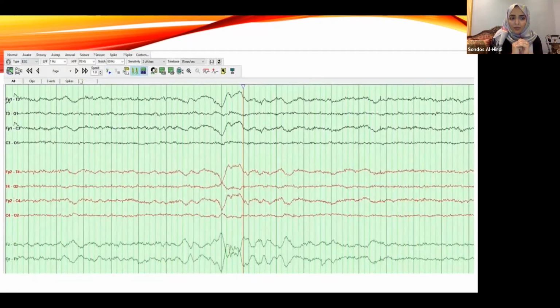If we look at the same page with the appropriate setting, you're going to say, again, there's not a clear, what we would call, underlying cerebral activity. These low voltage waves that are coming, it's very doubtful. This, of course, in the middle is an artifact. Keep in mind, these are most of the time ICU recordings, and so these artifacts are very common, but there's really no clear underlying cerebral activity that you could see.